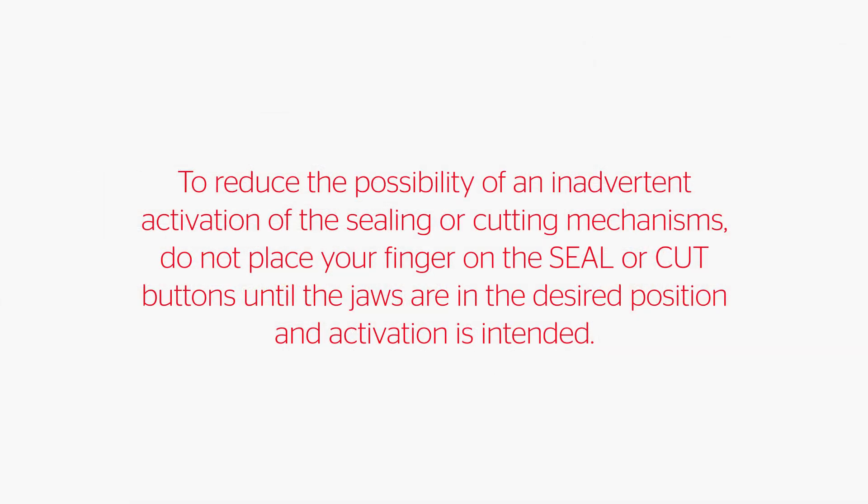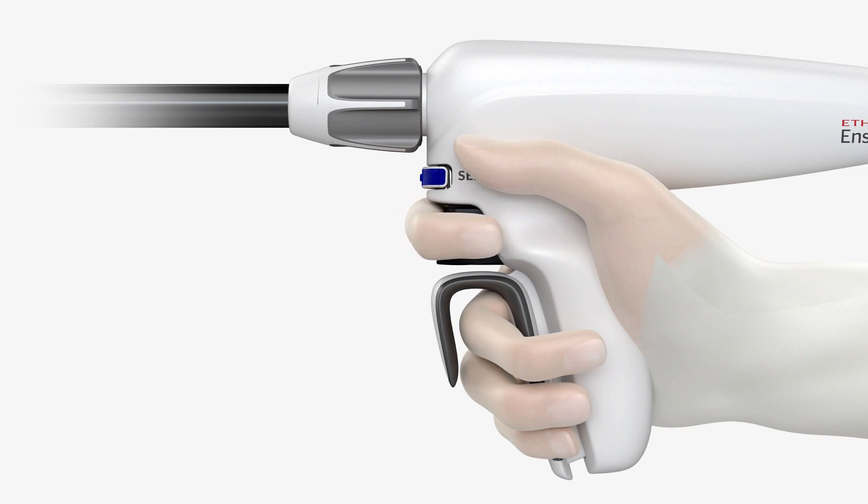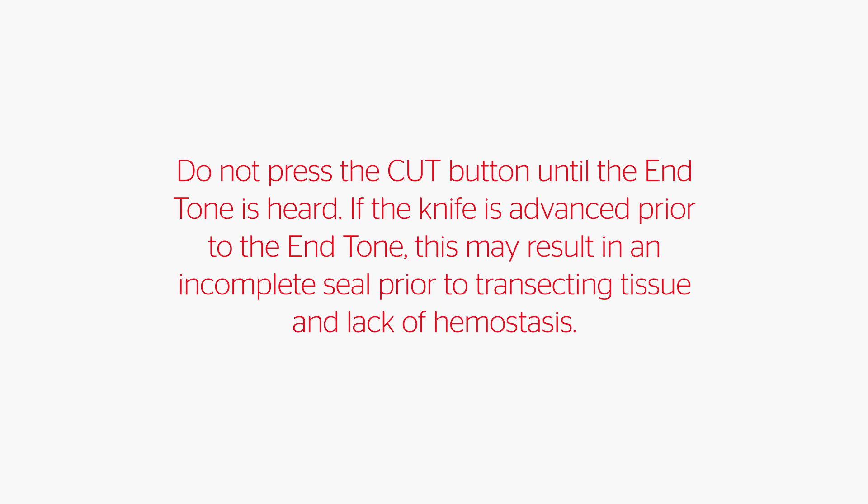To reduce the possibility of an inadvertent activation of the sealing or cutting mechanisms, do not place your finger on the seal or cut buttons until the jaws are in the desired position and activation is intended. Fully press the cut button against the grip housing. The knife will advance to the cut line. After the transection cycle is complete, squeeze the closing handle until it unlocks. Do not press the cut button until the end tone is heard. If the knife is advanced prior to the end tone, this may result in an incomplete seal prior to transecting tissue and lack of hemostasis.